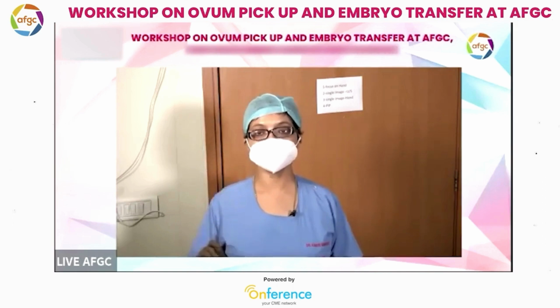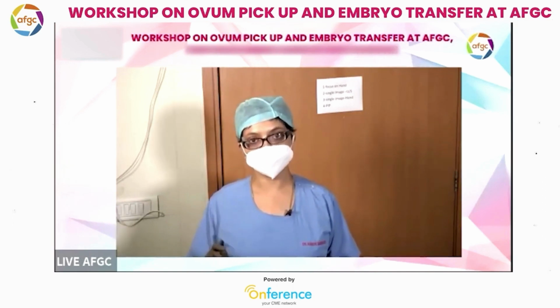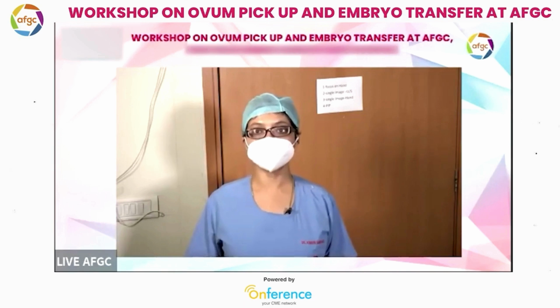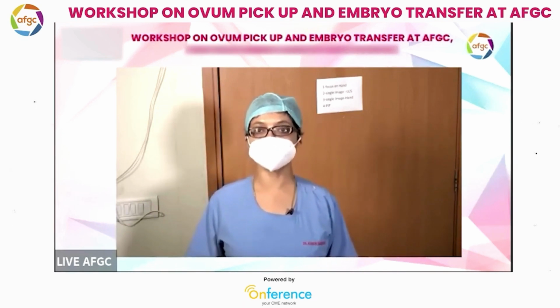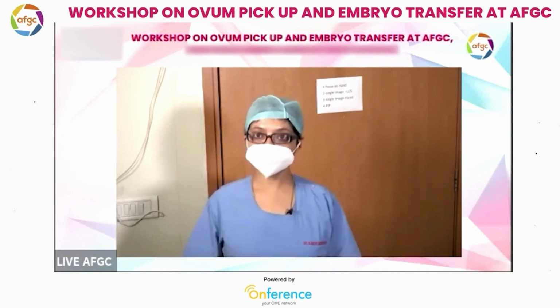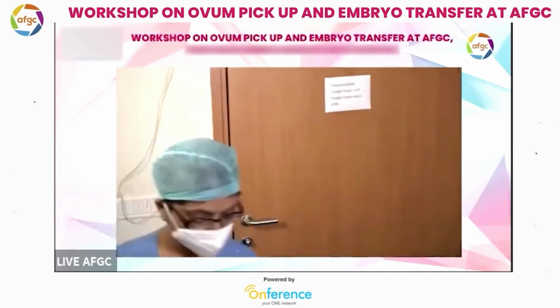And we must always take the verbal consent before doing the transvaginal ultrasound. Patient should be explained what the procedure is going to be. Tell her what the position is going to be, how we are going to insert the probe, and why we are doing this. After explaining everything, we take the position of the patient.